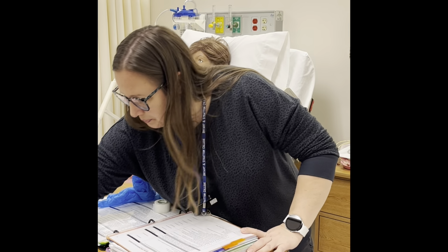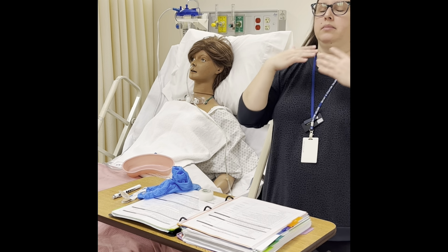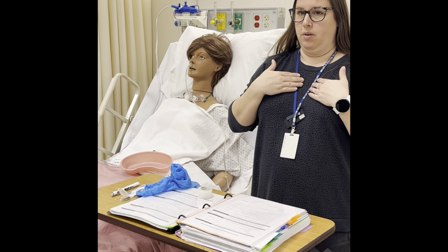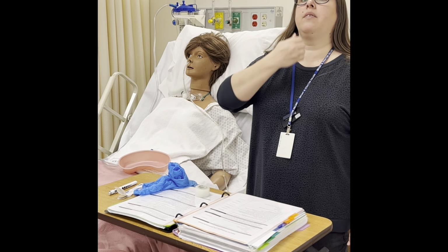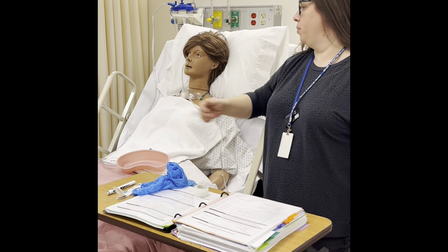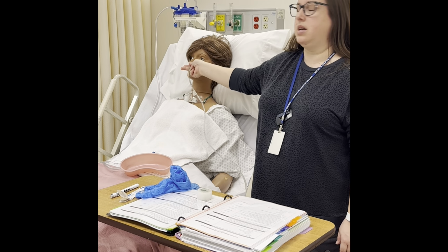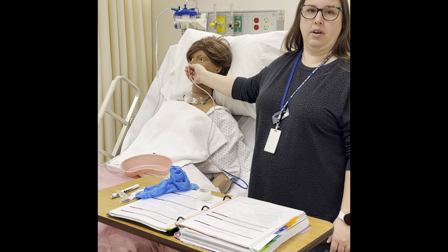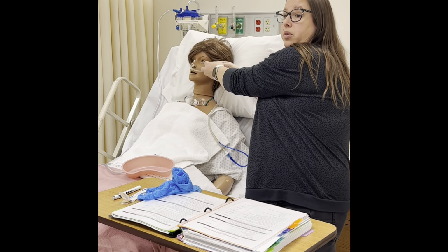And then it tells them in the video at ITI, it says, put their chin down. Okay, when you do this, how much room is your hand going to have for this person? Not a lot, versus here, you have more room. So I just say, just stick the tube in, and we're just going to keep advancing it till we get to our flag. We're at our flag.